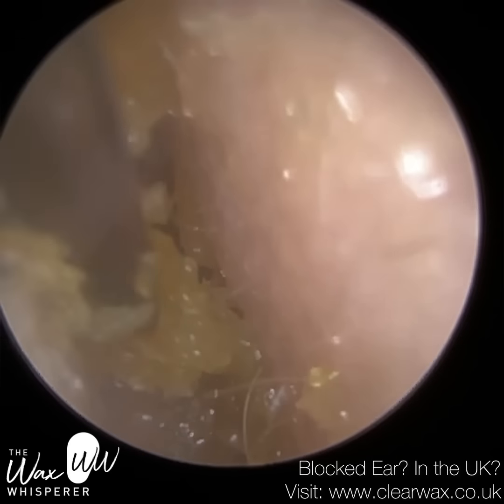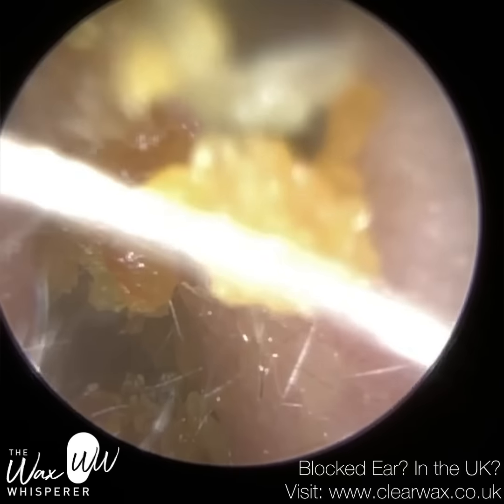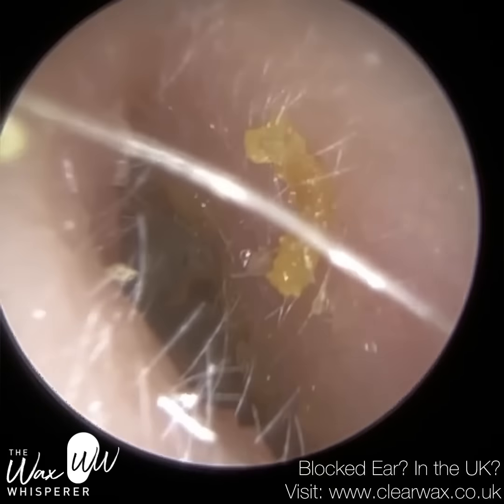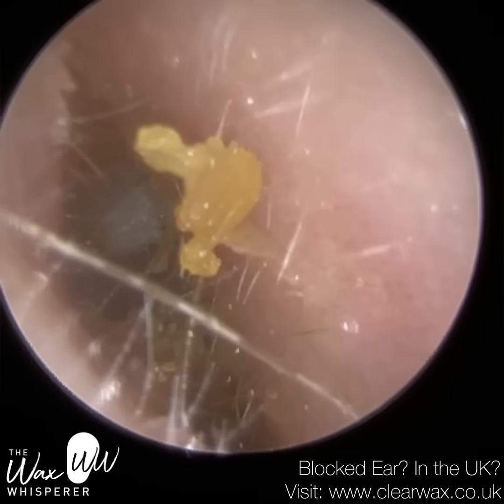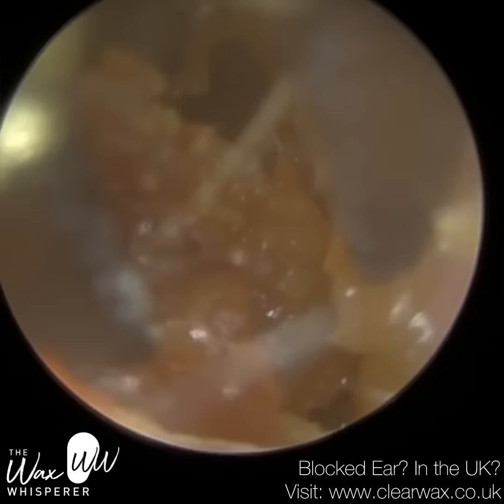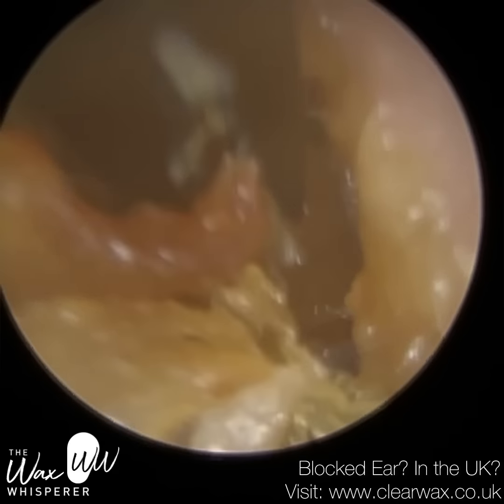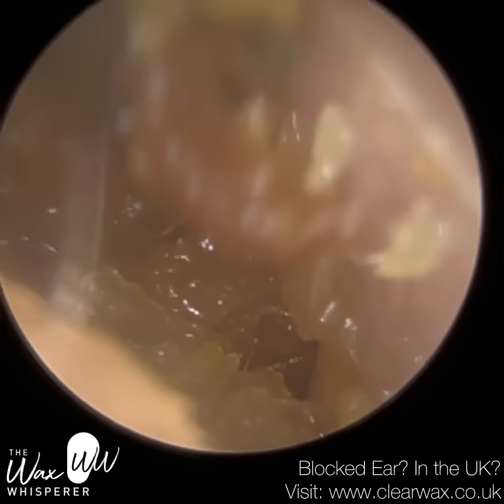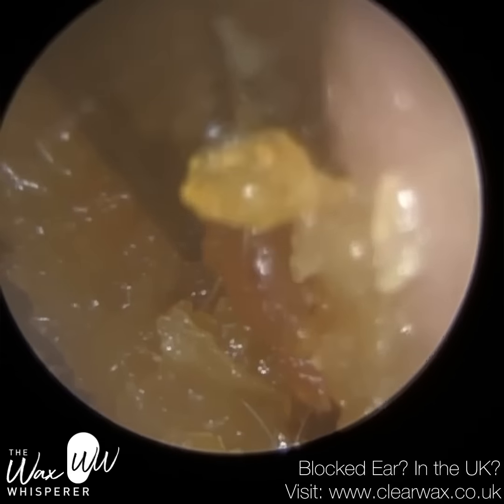So it's tilted obliquely. And because that center part of the eardrum is also pulled inwards, it's a conical shape. If you're looking at the eardrum from inside the middle ear towards the entrance, we call that a convex eardrum. So the pointed bit is coming towards us, but in this case, that depressed part is going away from us.